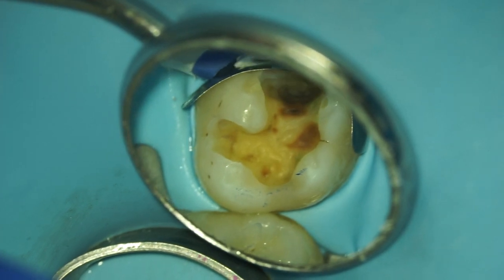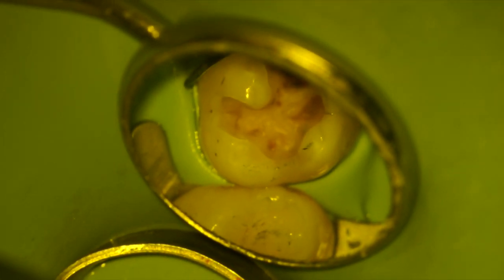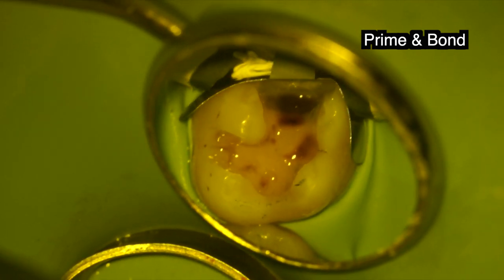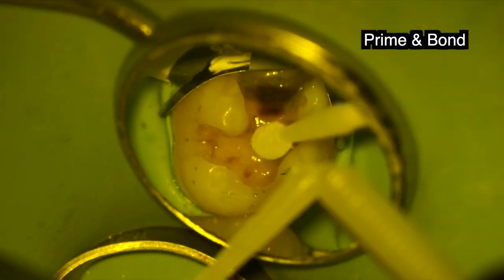After I remove the etching gel, I am turning on my yellow filter. Why am I doing this? The actual bonding liquid and the white filling material are triggered by blue light. But even in normal light, there is some blue light. By working under this yellow filter, I make sure that my white filling material is not going to set before I have had the time to shape it.